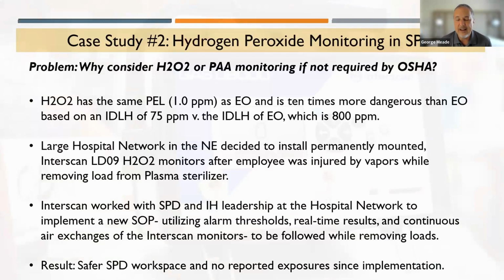About the time that plasma sterilization came out was right about the time when all the EO studies were coming out, explaining the health dangers of EO. So I don't think it was done intentionally, but there was a perception that, hey, this new plasma stuff is obviously safer than EO because I don't need to put up placards that say it causes cancer. So it must be safer, right?